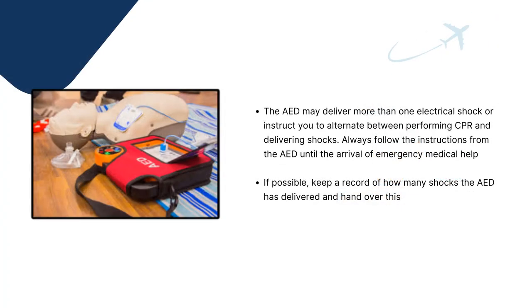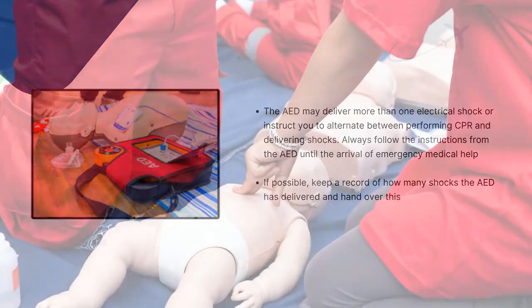The AED may deliver more than one electrical shock or instruct you to alternate between performing CPR and delivering shocks. Always follow the instructions from the AED until the arrival of emergency medical help. If possible, keep a record of how many shocks the AED has delivered and hand over this information.